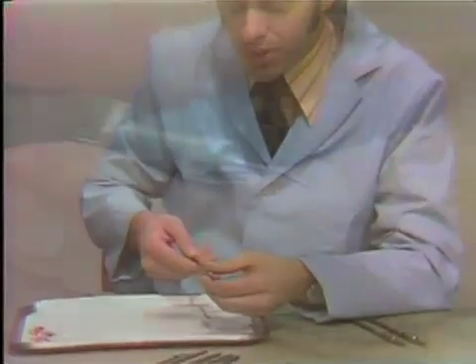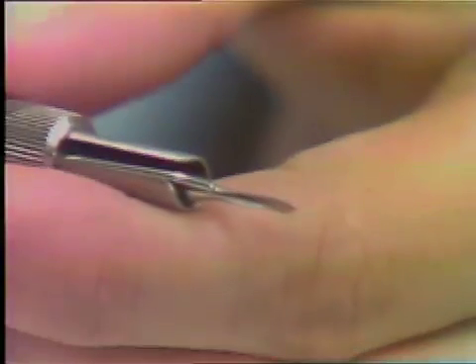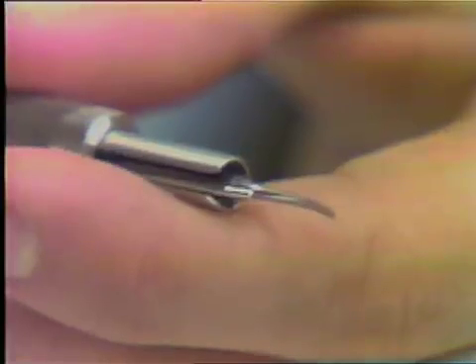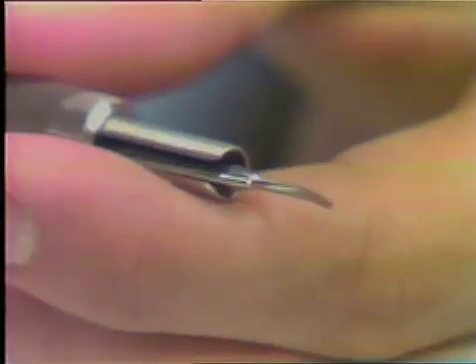Usually when the ultrasonic instrument comes, it comes complete with probably three tips. The first tip, called the P1, is used basically for scaling supra and subgingival calculus in the anterior portion of the mouth, probably including the anterior teeth and as far back as some of the bicuspid teeth. It is also recommended for removing amalgam overhangs.